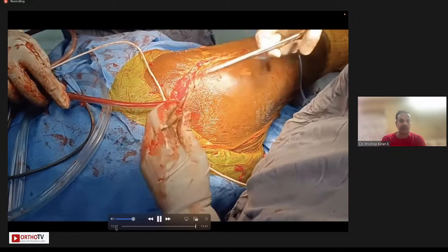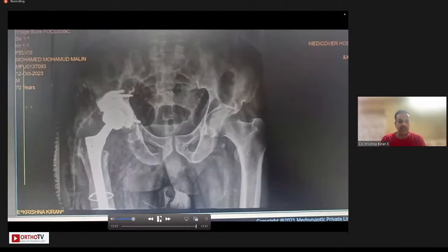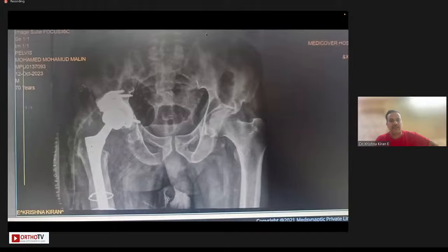And that's how the post-operative X-ray looks. You can see the inferior fixation into the acetabulum. You can see the superior augment. And you can see that the construct is relatively stable. And this patient is about a year out, or I think a few months out, and he has done reasonably well so far. Thank you.